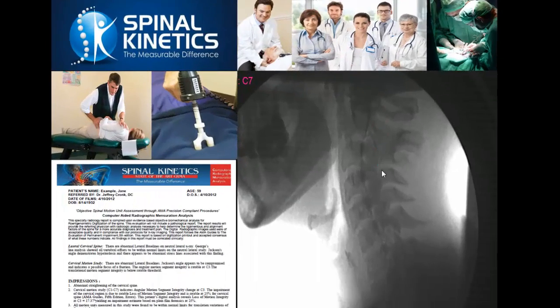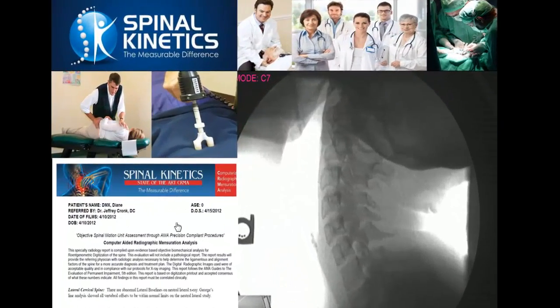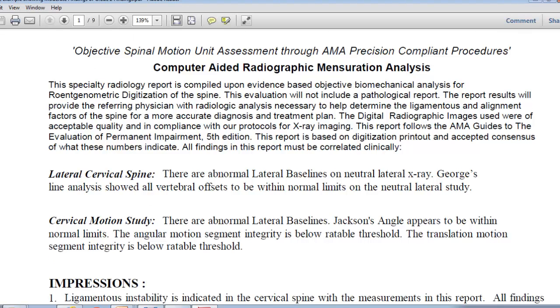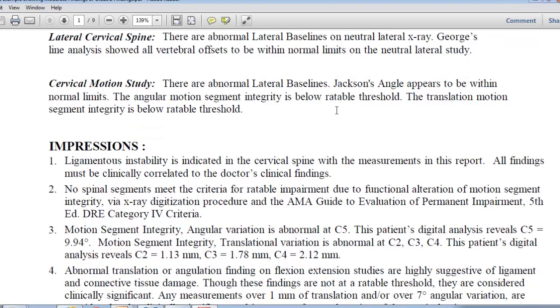Now looking at a DMX — another form of taking an x-ray — with the patient in flexion and extension, we pull up the report. On the lateral cervical spine, George's line is within normal limits. On the cervical motion study, we don't have anything rateable or significant-severe, though moderate findings can be clinically significant. Going into the body of the report, we do see definite ligamentous laxity or detectable joint laxity on x-ray — giving us a Grade 2 sprain finding.